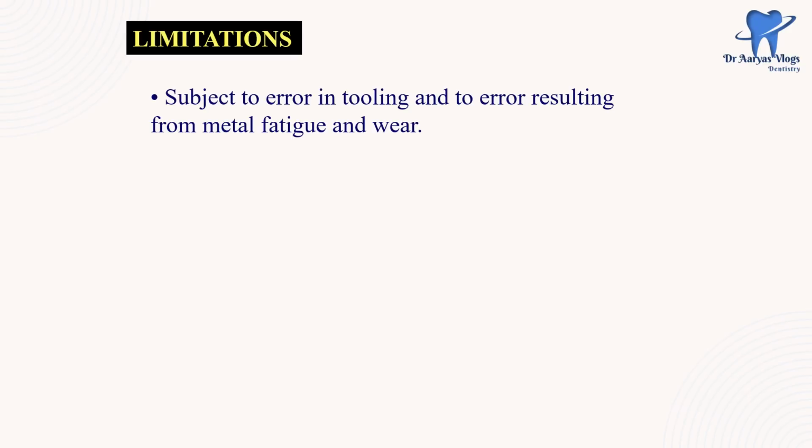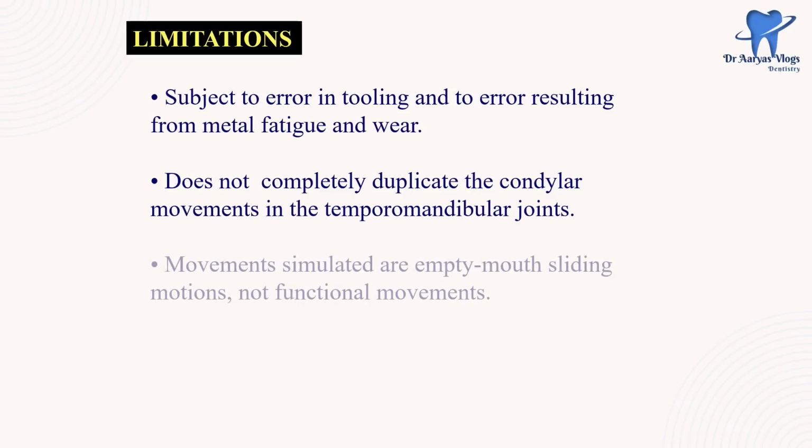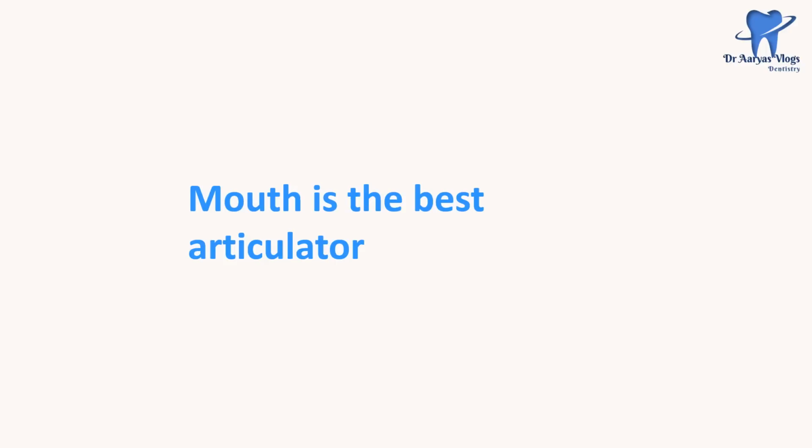And finally the limitations: subject to error in tooling and to error resulting from metal fatigue and wear. It does not completely duplicate the condylar movements in the temporomandibular joints. Movements simulated are empty mouth sliding motions, not functional movements.